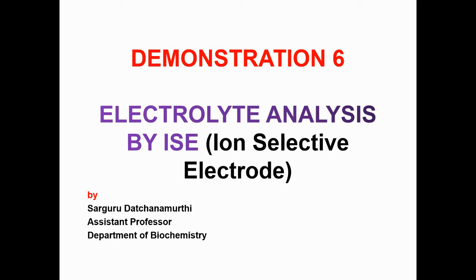Out of these electrolytes, sodium, potassium, and chloride are the most important, and these three are routinely estimated in the plasma or serum in our clinical laboratory.